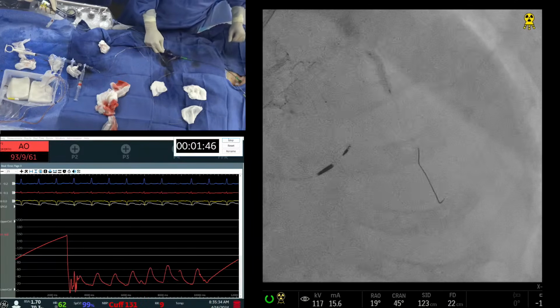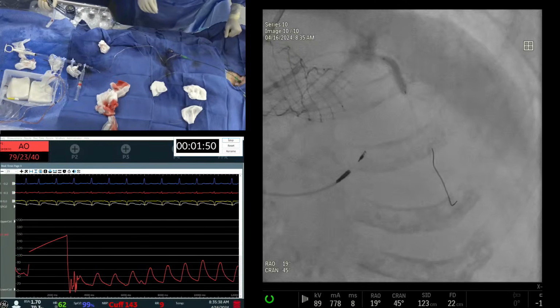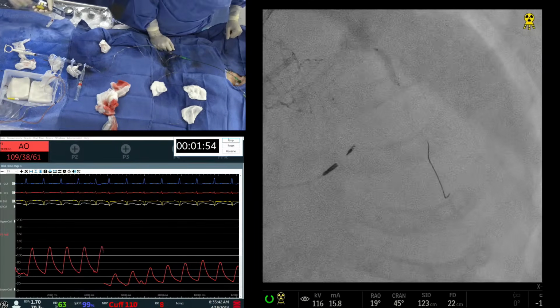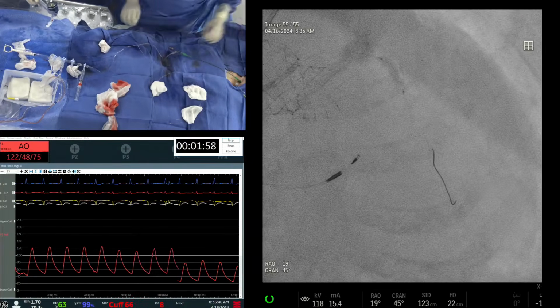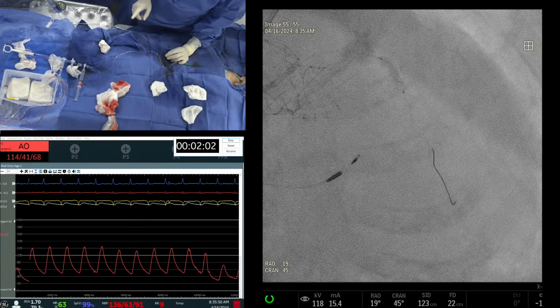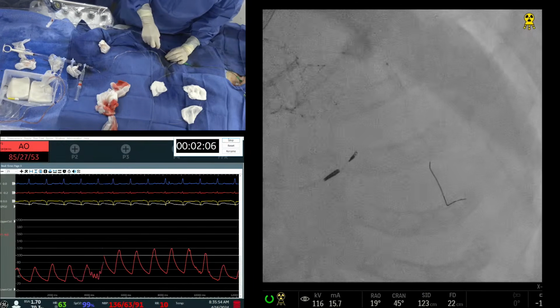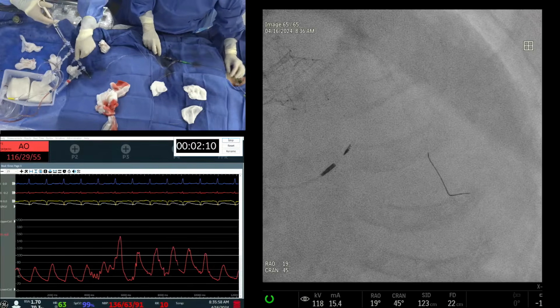Trying to stay away from that distal tortuosity. Because you start getting a diagonal, and particularly the diagonal in 7 or 8 years has actually changed by 10-20%. The old angiogram was 50-60%, now maybe 70%. You want, what did you say, 3.5 proximally? I don't know. To me 3.25 looks good. Okay, take us in now. Yeah. Ready? Good.